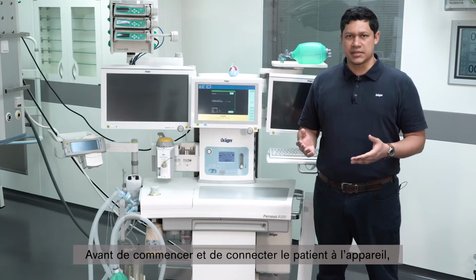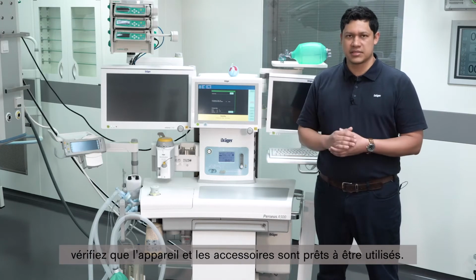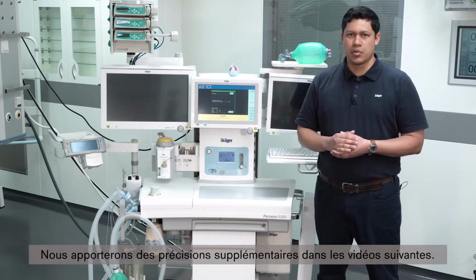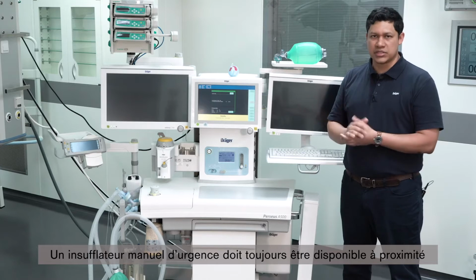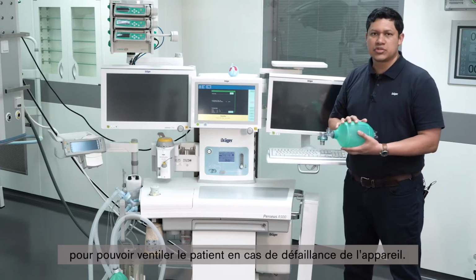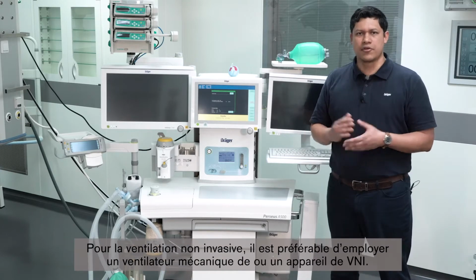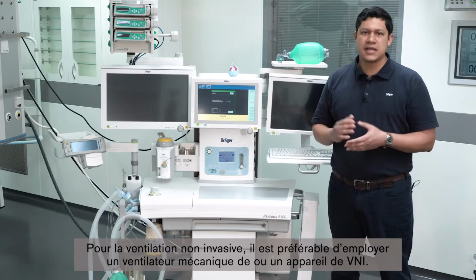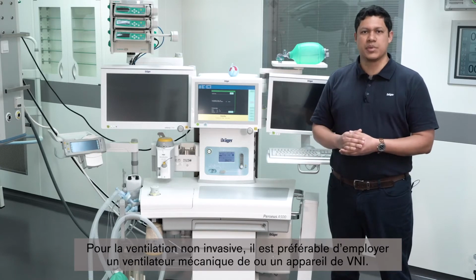Before starting the case and connecting the patient to the system, verify the readiness of the device and the accessories. We will cover further details in following videos. An external resuscitator must always be available at the workplace. This is to secure ventilation of the patient in case of failure of the system. For non-invasive ventilation, ICU mechanical ventilator or non-invasive ventilator should be preferred.